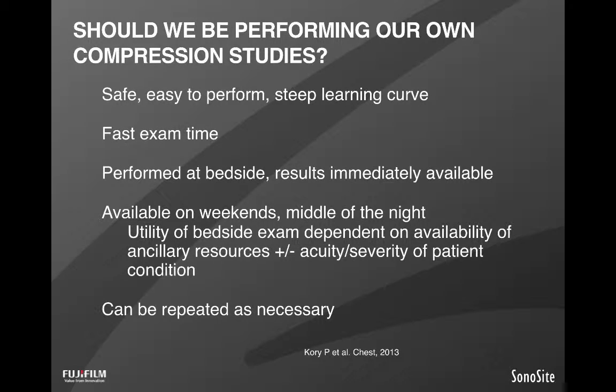The other question that some people ask is not only whether you have to use those other modalities, whether you have to examine the calf, which I've already addressed, but should we be doing it as clinicians? And I'll tell you, we're here having a webinar today. The answer can only be yes, and I'll tell you why in a second. And largely because it's so practical, and I'm going to go over the literature, that we can actually do it quite well, especially in the ICU.